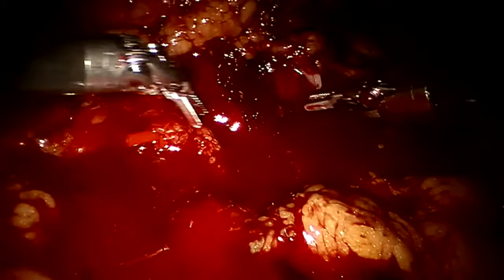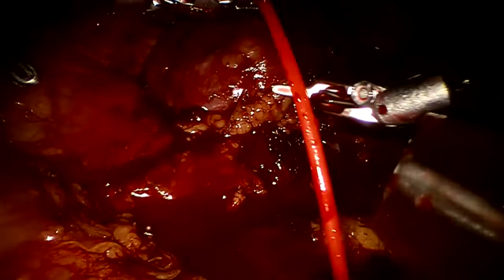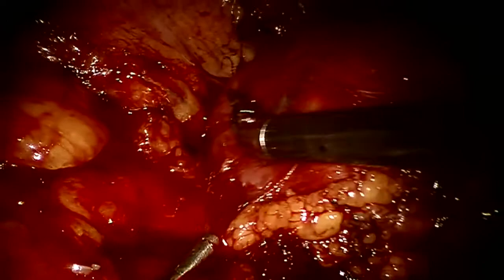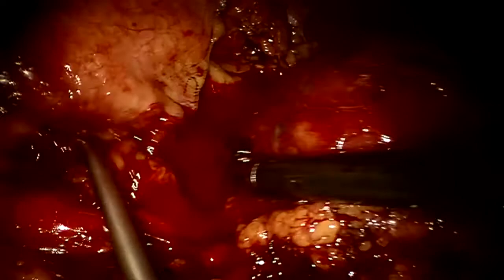So again, I was saying that if this tumor was not as much invading the parenchyma and a little smaller, et cetera, and a little more towards the hilum than this one, then potentially we could have gone at it completely unclamped. The strategy would be to go from the hilum towards the kidney and take every branch that is supplying the tumor and just go into the renal sinus in the Gil-Vernet plane and devascularize the tumor that way.